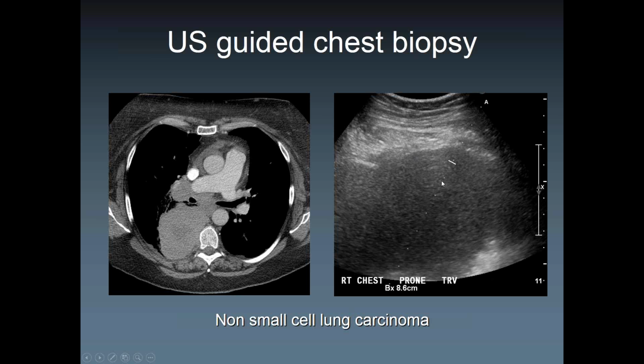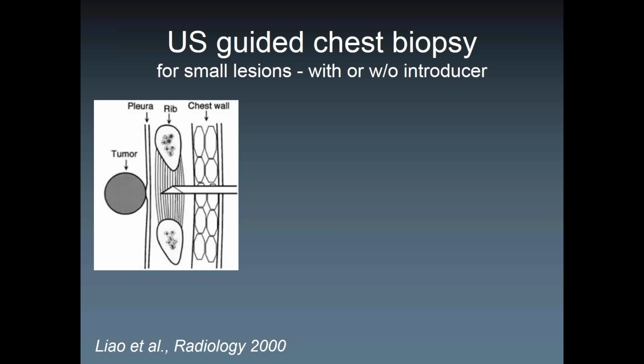So why would I do it with ultrasound? Why don't you want to do it with CT? Well, with ultrasound, you have the huge advantage of real time, right? Remember, with CT, you only have the patient take a breath in, you scan, breathe out. While you scan, you cannot bring the needle in, because it's in the scanning plane. Your hand is in there, or some holding device, right? So you want to just scan incrementally, even though we have the step and shoot technique or the fluoro technique. It's not the same as real time.